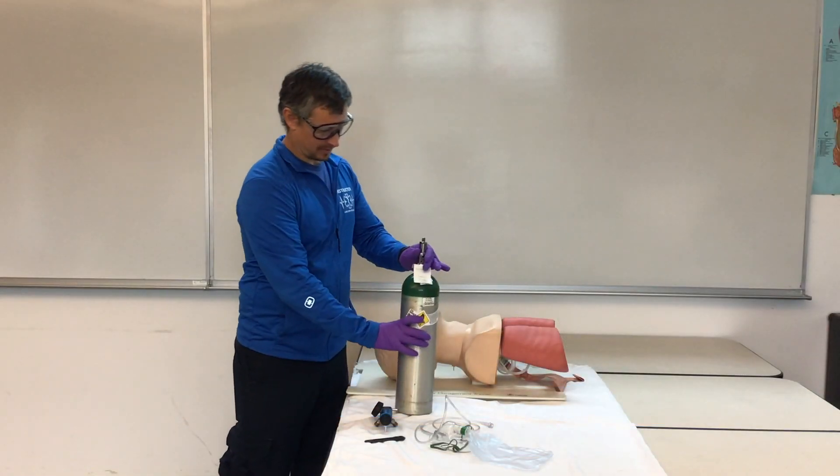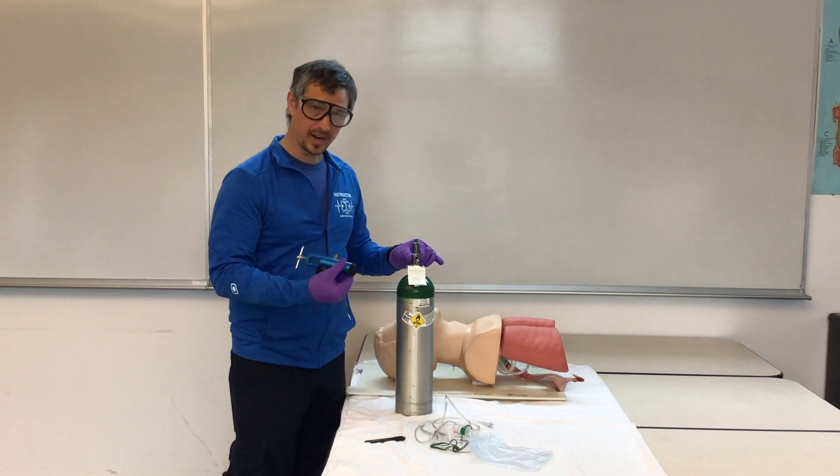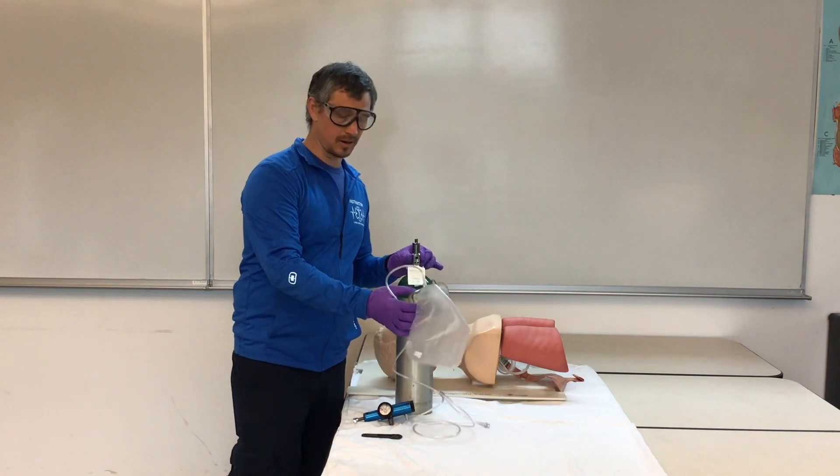For oxygen administration, we need an oxygen tank, a regulator, an oxygen key, and a device to administer our oxygen.